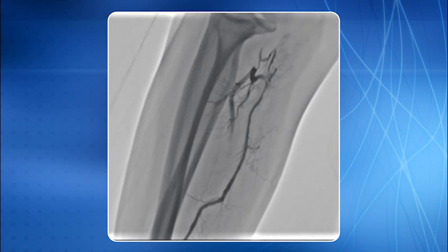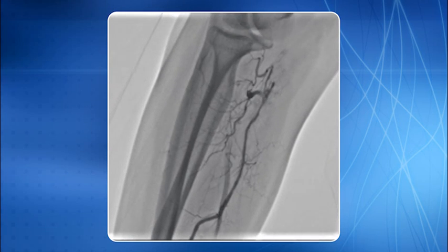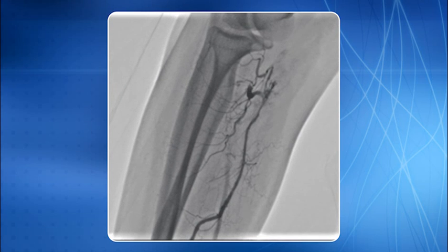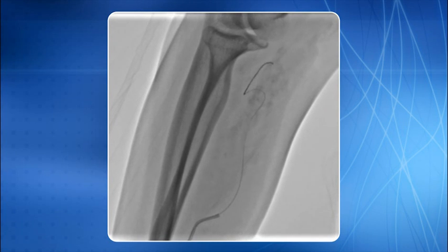This is an example of a loop which was complicated by perforation in its proximal segment. It happened because of repeated push of the wire and catheter in this region. A 0.014-inch soft tip PTCA guide wire was carefully negotiated beyond the perforated segment and the loop.